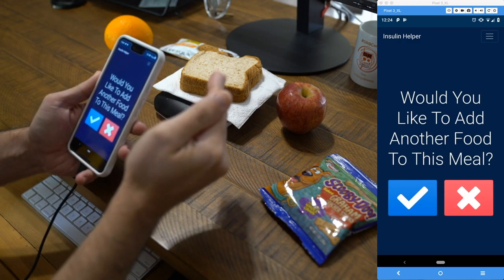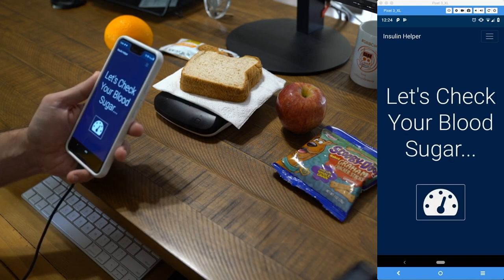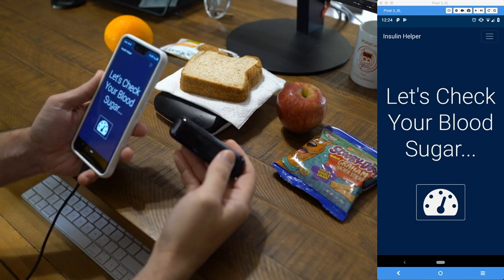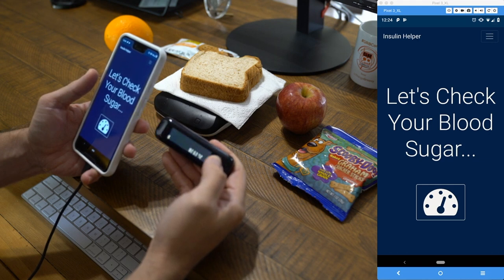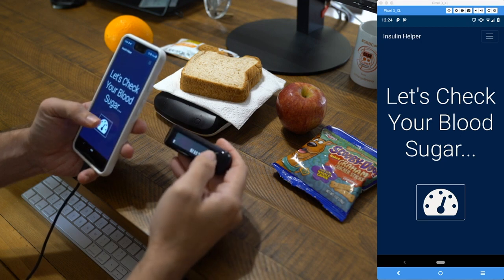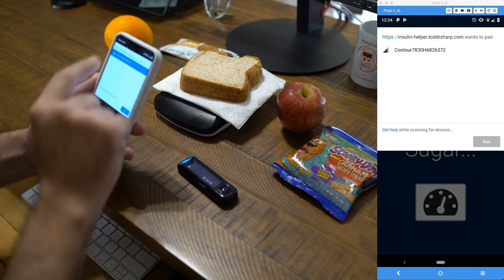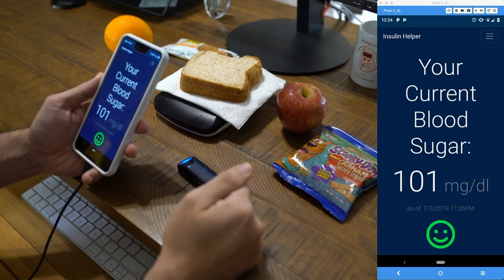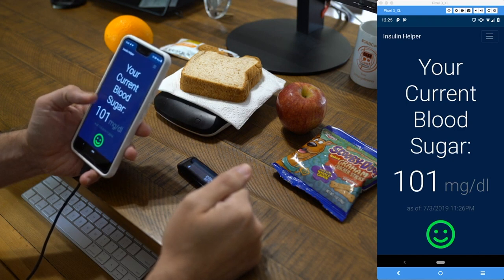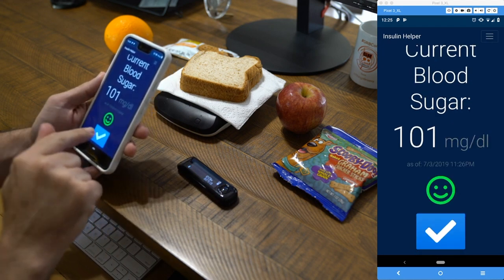Now that we've entered all our foods we say no to adding more. We check our blood sugar using a Contour Next One glucose monitor. We turn it on, hold the button to put it into Bluetooth pairing mode — you can see the blue light flashing. Once it's in pairing mode, we pair it with the application by clicking the meter button and selecting our device. It reads our last glucose reading: current blood sugar is 101 milligrams per deciliter. We get a green smiley face because that's within our target range.